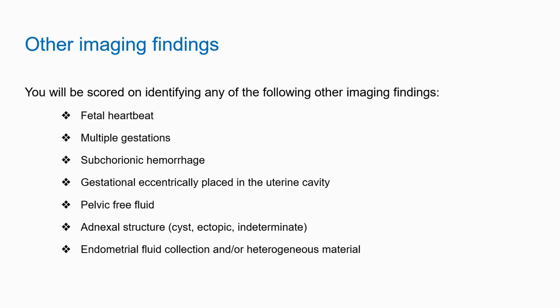This again is a list of other pregnancy-related imaging findings that might be significant in a pregnant patient that is symptomatic.